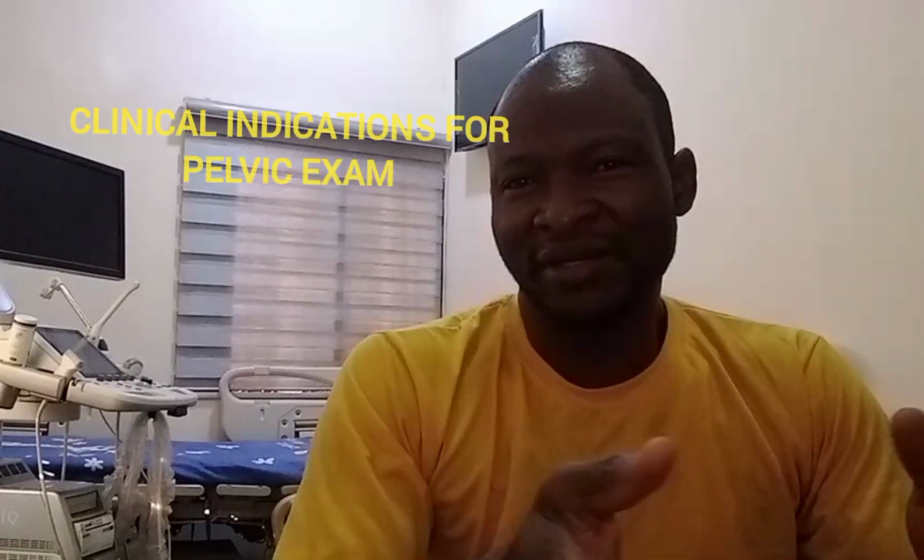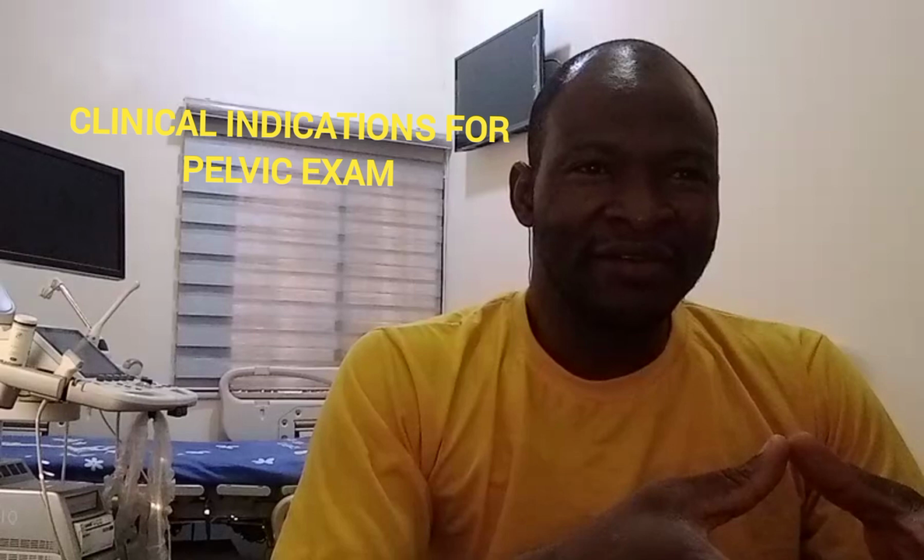Now, when we do ultrasound for gynecology, basically we're looking at the female pelvis. So why do we do gynecologic sonography? What are the clinical indications for pelvic ultrasound? Evaluation of gynecologic complaints is one of those many reasons.